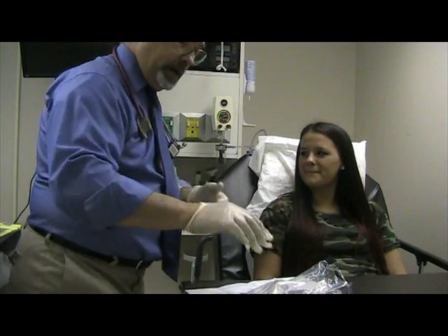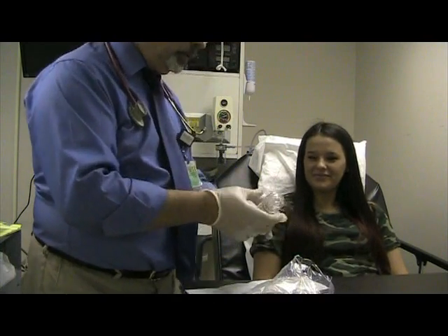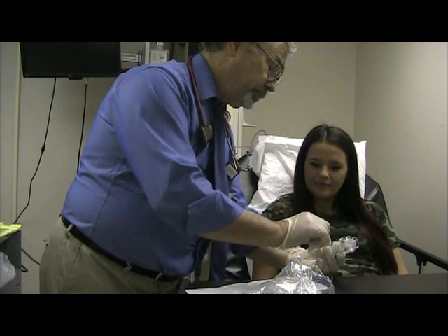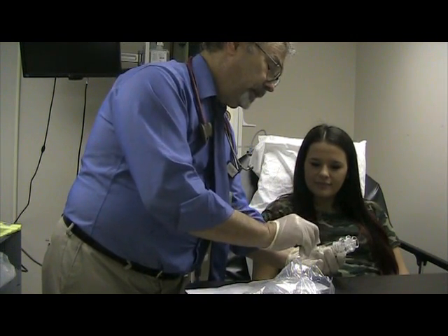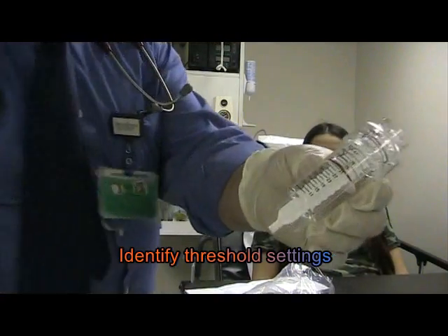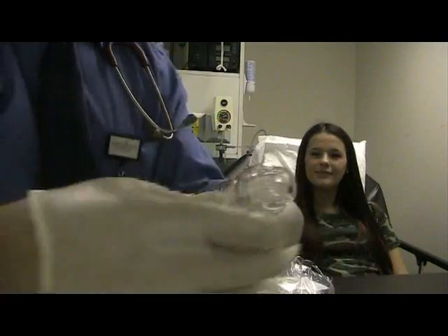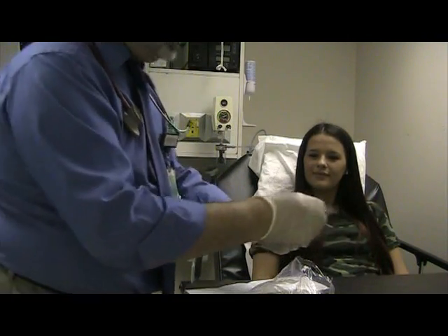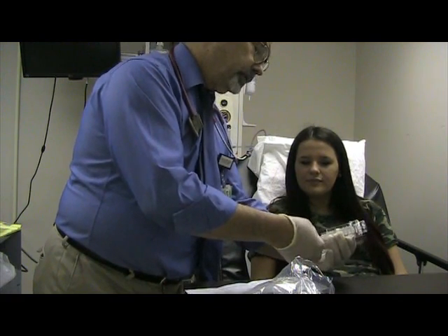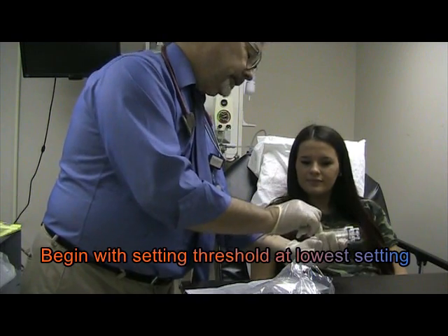This device has different flow and pressure settings, all the way from 9 up to 41. I'm going to set this down really low and all I have to do is rotate this until I get this red line down to the bottom.